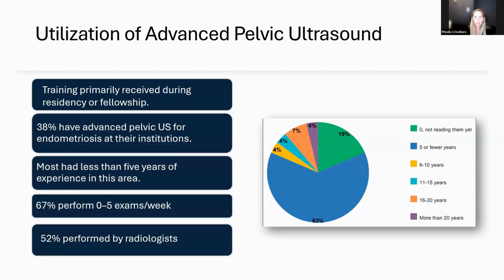So this kind of low utilization and limited experience highlights a gap in both practice and training, suggesting that we need to enhance educational resources for those interested in performing these studies. So most of the studies were performed by the radiologists, and this also ended up being one of the challenges of implementing advanced imaging with ultrasound.